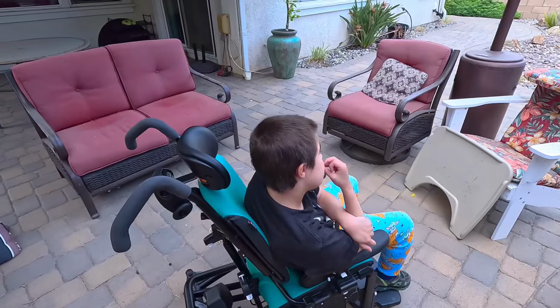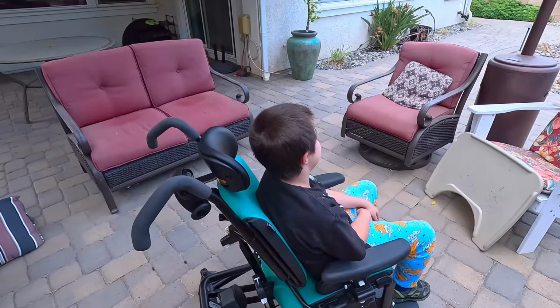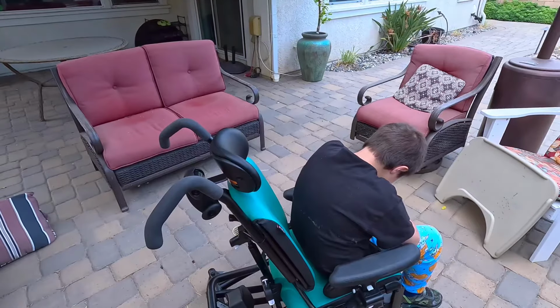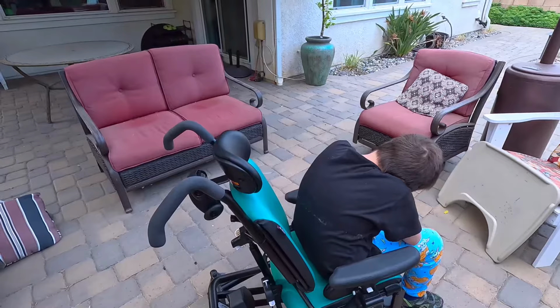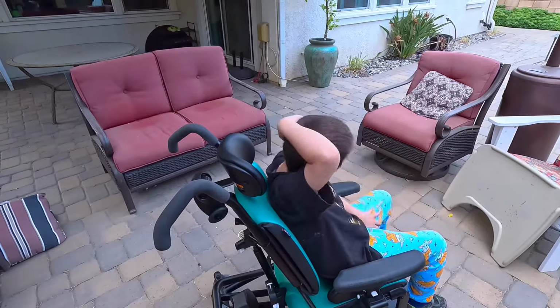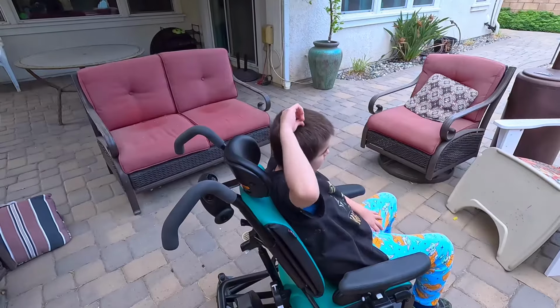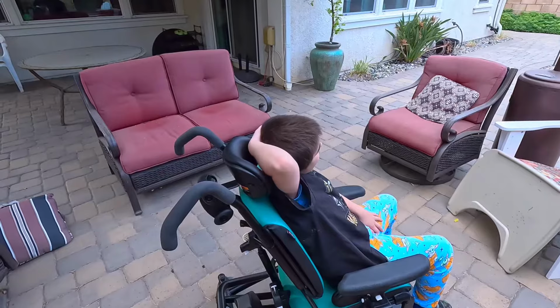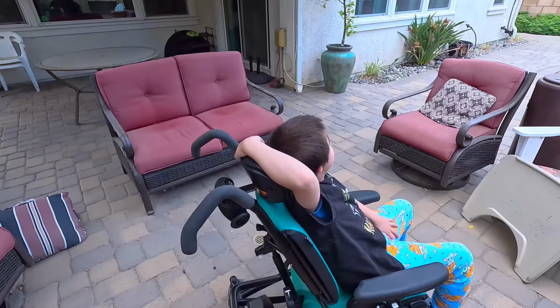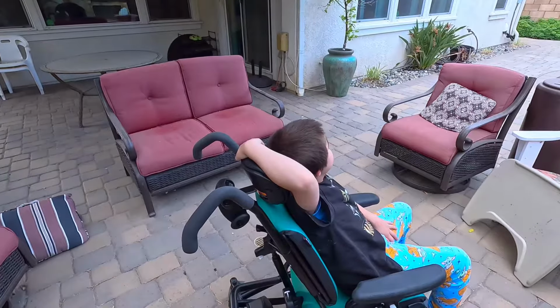Some final comments. For safety reasons, only staff should be the ones that transfer Billy in and out or push him in the chair. There should never be students that assist with this. Obviously, if they were to forget to use the casters or something like that, or go next to the stairs, it would be very risky. And also, the chair should never be on rough or uneven terrain or near the stairways.